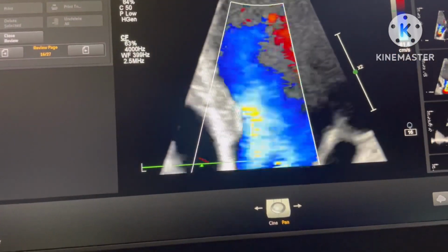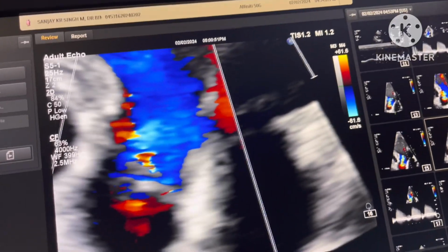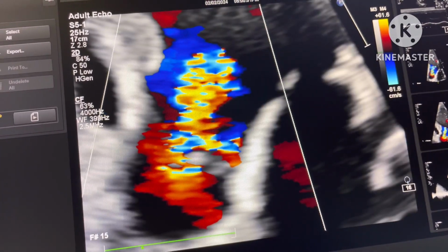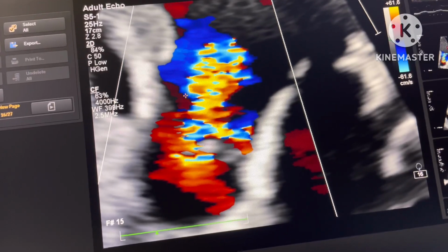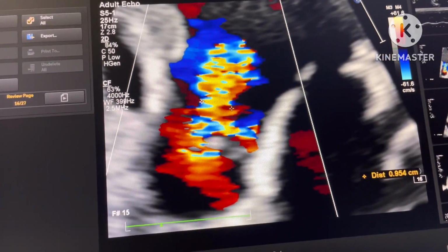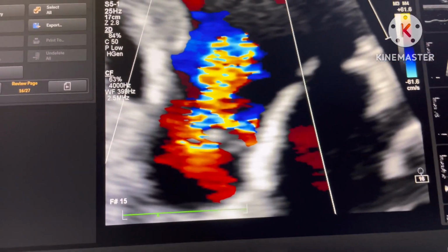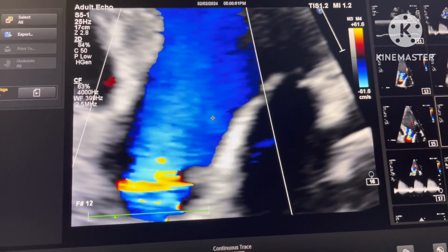So in this image, I'm just zooming the image to show you. This is the cine image. I'm moving the cine image. So you get zoom and cine image. The part of this jet where it is minimum, here it is minimum. You can see the minimum portion is also almost coming around 9 millimeter. And when we take it like this, okay, cine image.